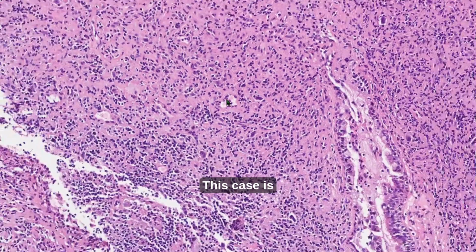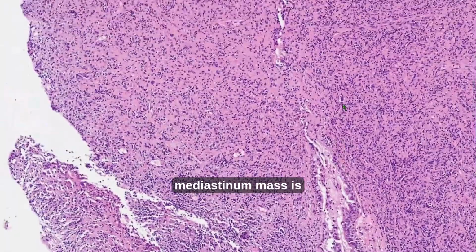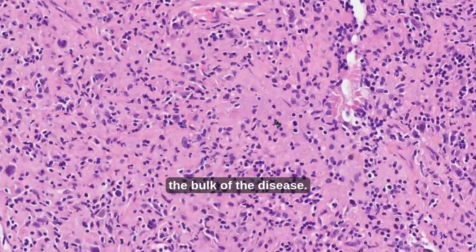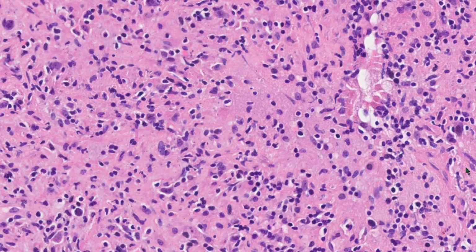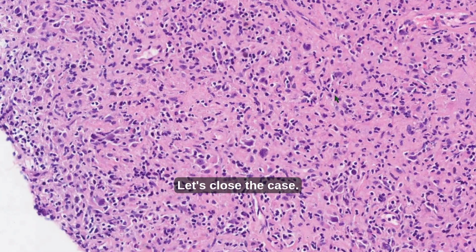In this case it is highly probable that the mediastinal mass is the bulk of the disease. Let's close the case. It's signed out as an endobronchial presentation of a classic Hodgkin lymphoma.